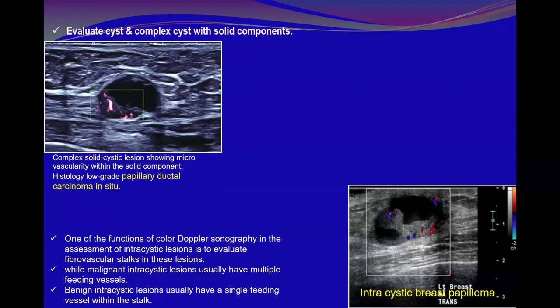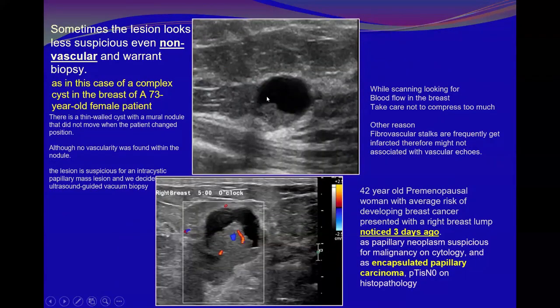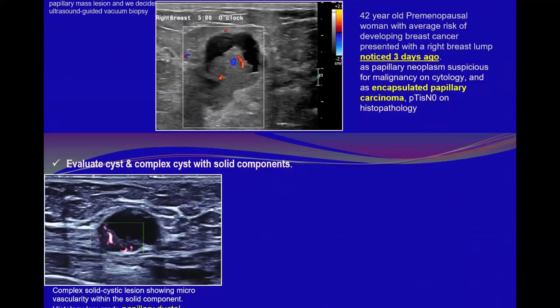This is avascular. Avascular maybe, or more fibrous, rich in fibrous tissue, leading to loss of vascularity. Yes. Absence of color flow will not exclude whether this is a tumor or not. And there is another issue: if it becomes necrotized, sometimes the fibrovascular stalk gets infarcted. It might not give vascularity because the fibrovascular stalk can twist, and when it twists it can infarct and lack vascularity. And the other cause, as you mentioned, is fibrosis. Excellent, well done.